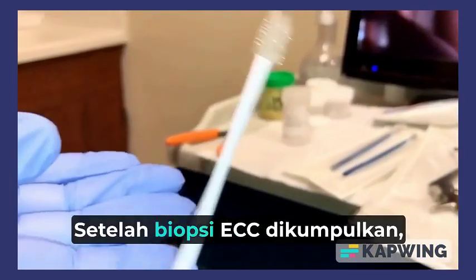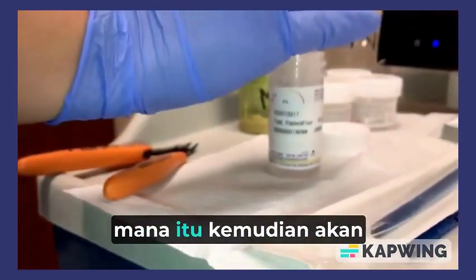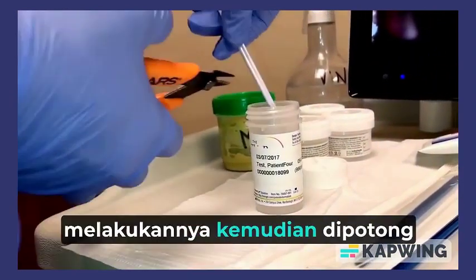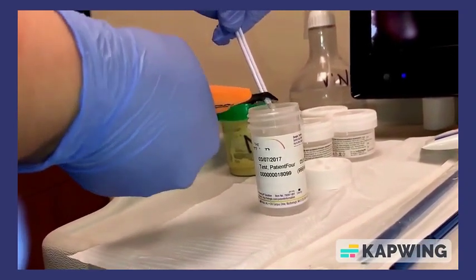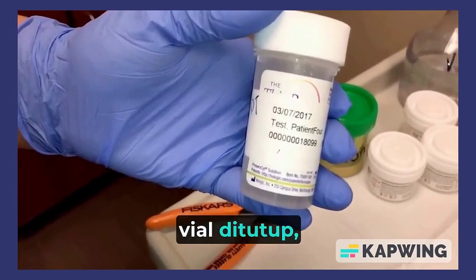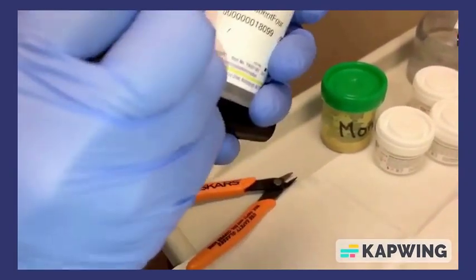After the ECC biopsies have been collected, it will be passed on to the MA, where it will then be placed into the thin prep vial, and they will be then cut with the wire cutters. When that has been cut and the vial is closed, it will be labeled ECC.